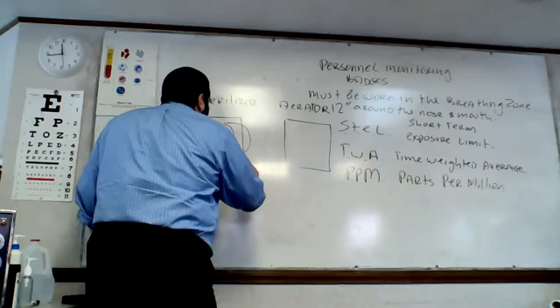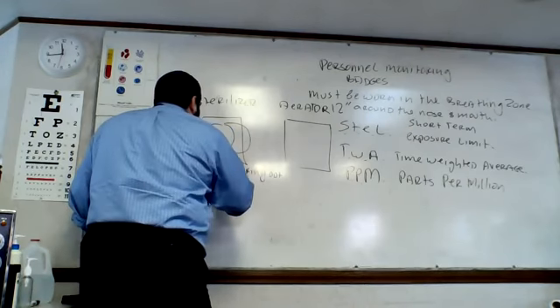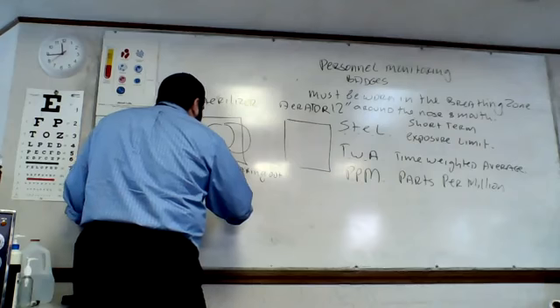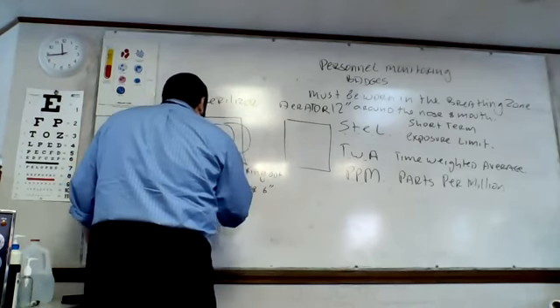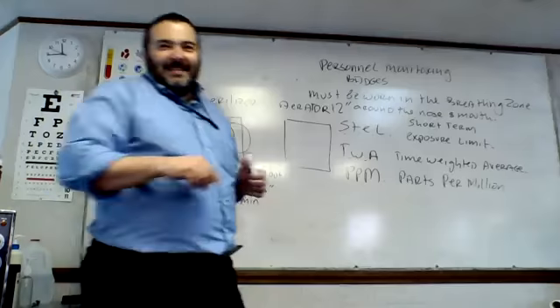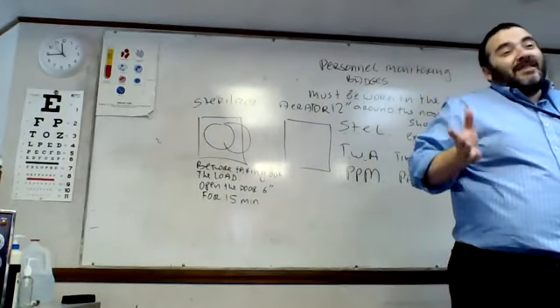Before you take out the load, open the door 6 inches for 15 minutes. Let it breathe out. So how do you know how wide the door is?